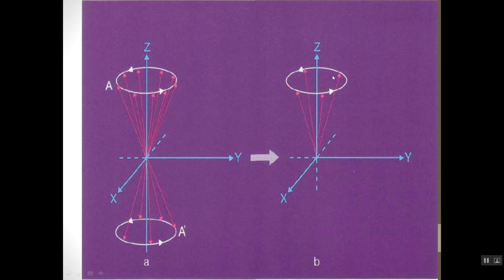This current is my signal, which I use to form the image finally. So to discriminate between the signal from the protons and the main magnetic field, I have to give some energy to the protons to be in another direction. After that, it will be easy to detect the signal from the protons, because they will induce a signal in the XY direction, not in the Z direction.